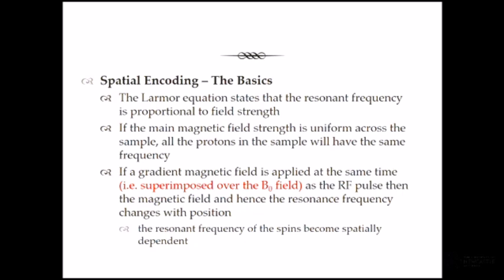If you look at the history behind MR, two Nobel Prizes were given for the invention of MR. One was the recognition that different tissue types had different T1 and T2 relaxation times, so therefore we could tell the difference between normal tissue and cancer. The other person that got the Nobel Prize came up with the idea of how to actually work out where those signals came from.